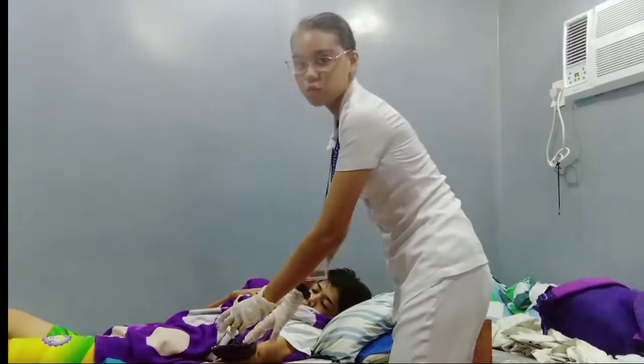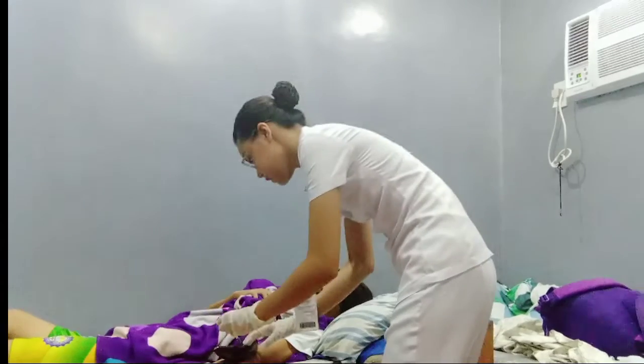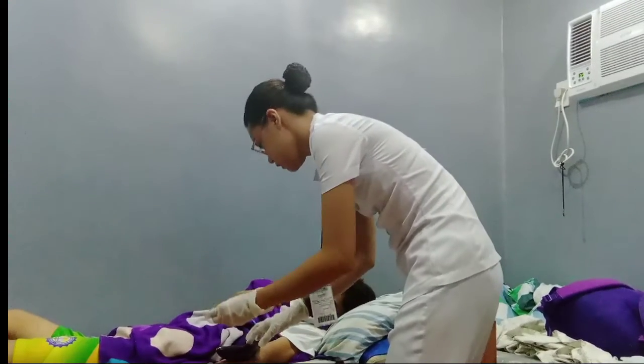Okay, afterwards we need to withdraw the needle at the same angle it was inserted and pat dry with a cotton ball. Do not massage the area. Okay, withdrawing, and cotton ball.